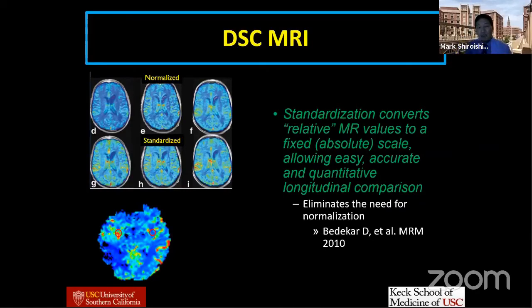And so you can get tremendous user influence. The radiologist starts to influence the measurement, and that's not something that you really want. And so the standardized algorithm is really nice because you don't have to do this anymore.